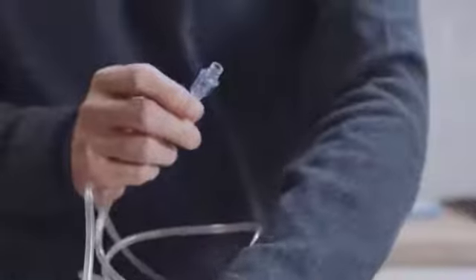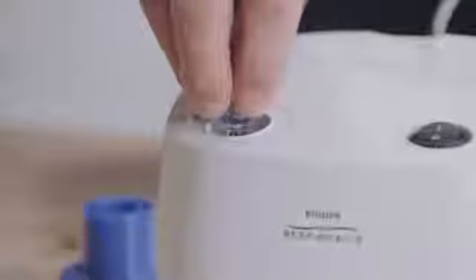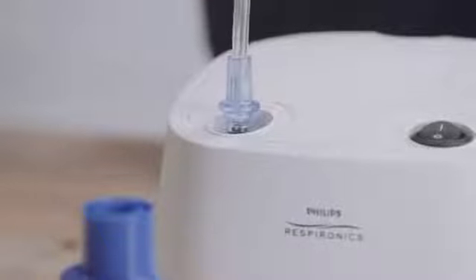Assemble the SideStream nebulizer cup and air tubing together as shown. Attach the other end of the tubing to the air outlet on the compressor. Both ends of the tubing are the same.